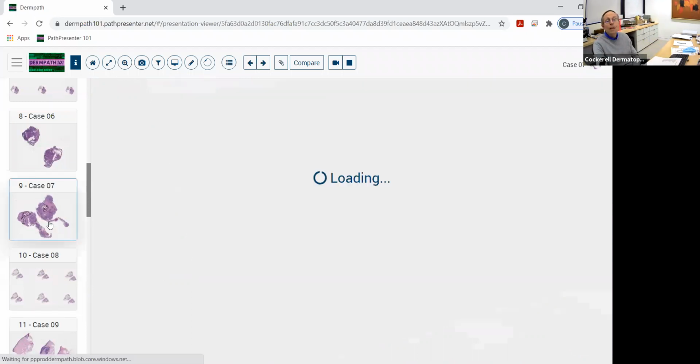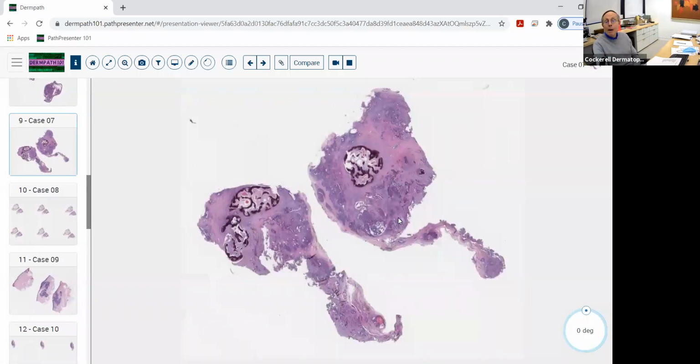Okay. Now this lesion, a relatively common lesion, and notice the technique here. This was taken by an enucleation technique. So a patient comes in, they've got a subcutaneous nodule, rubbery, you feel this. These usually don't have any pain to them. We all know that there are some adnexal neoplasms that are painful. We'll talk about those in a minute, but this is not one that was painful. You think it's a cyst, you do a little incisional biopsy, it pops out, and this is what you see.